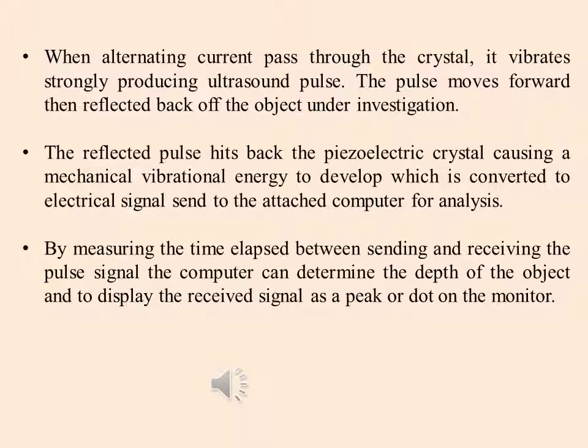The pulse moves forward, then is reflected back off the object under investigation. The reflected pulse hits the piezoelectric crystal, causing mechanical vibration energy to develop, which is converted to an electrical signal sent to the attached computer for analysis. By measuring the time elapsed between sending and receiving the ultrasound pulse, the computer can determine the depth of the object and display the received signal as a peak or dot on the monitor.